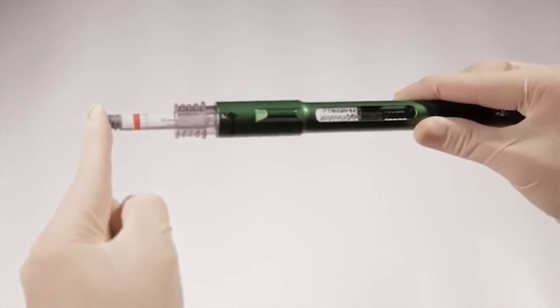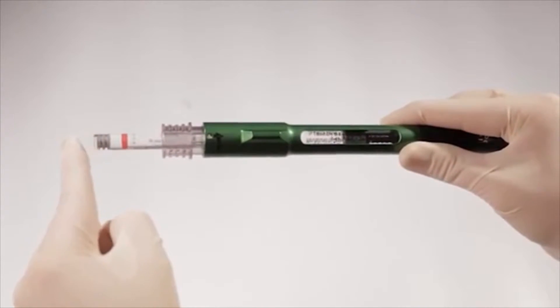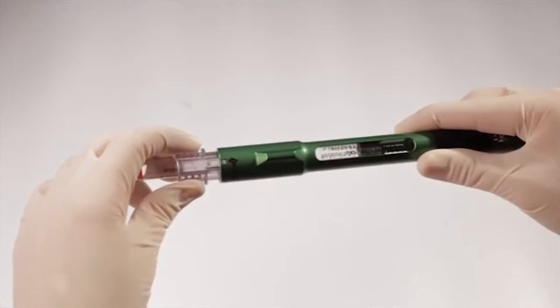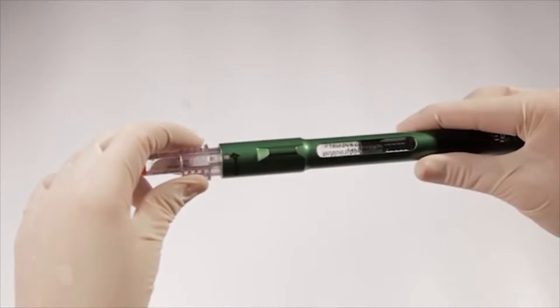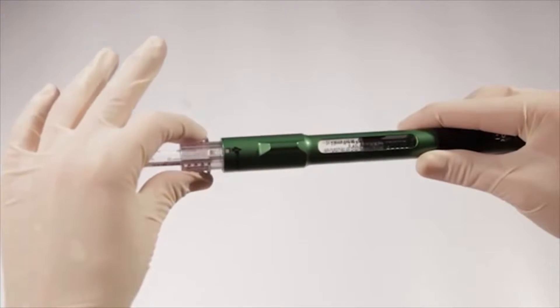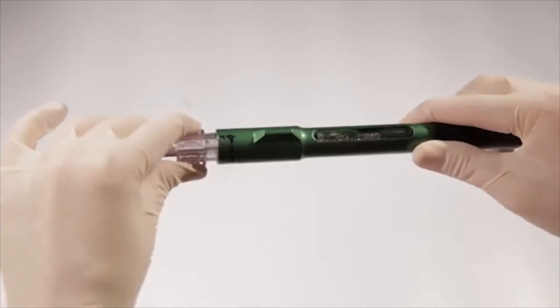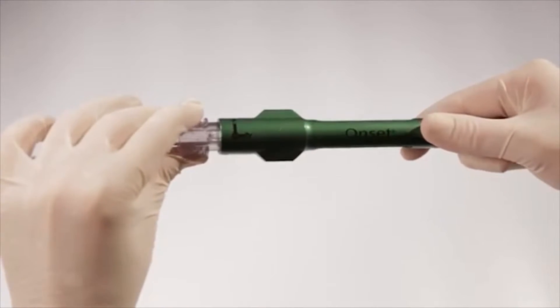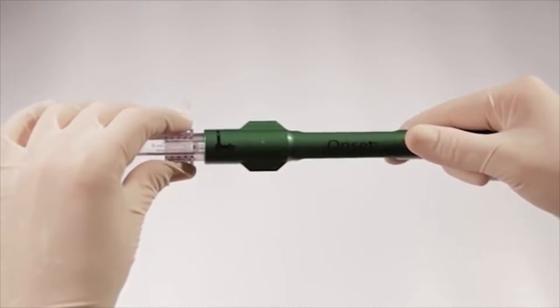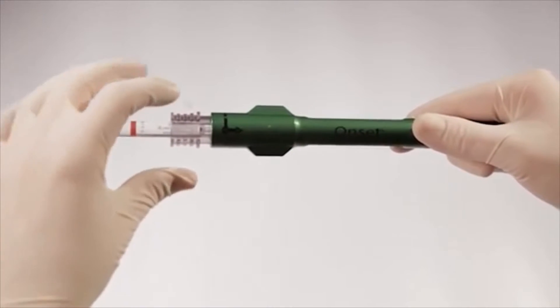You'll feel a slight resistance as the metal cap slides into place, which is an indication you've fully seated the cartridge in the number one position, which is necessary for an effective transfer. Once the cartridge is fully seated in the number one position, grip the connector with your thumb and forefinger and turn clockwise approximately one quarter turn to the number two position.